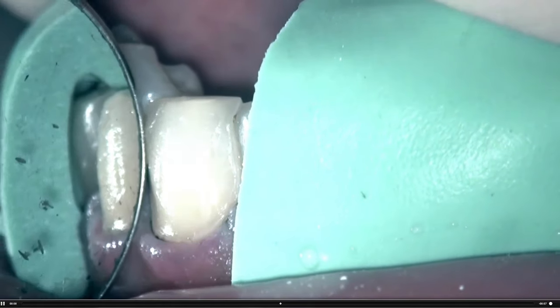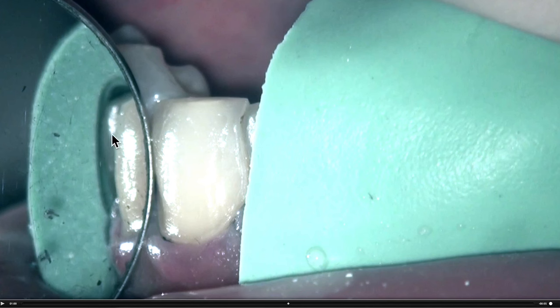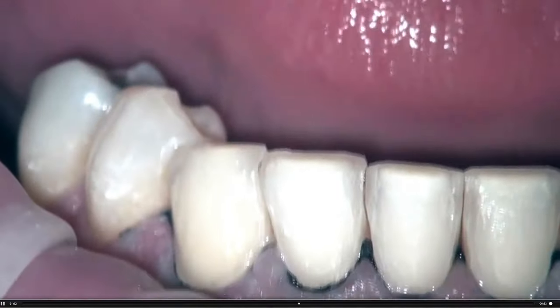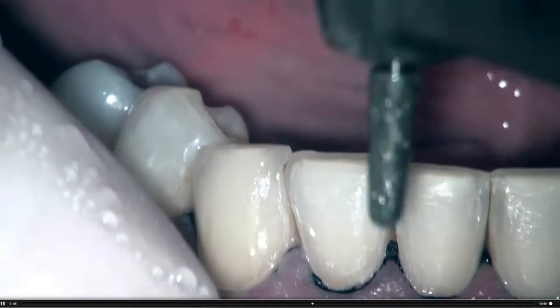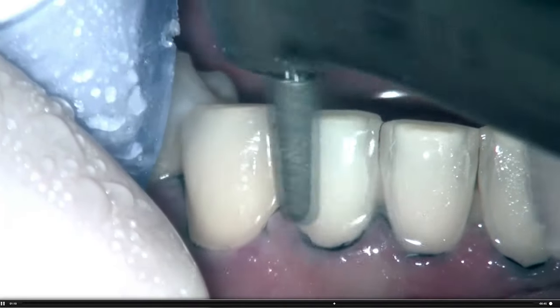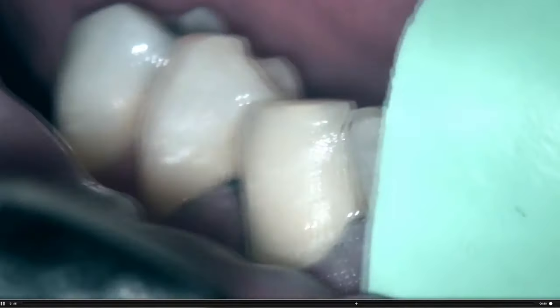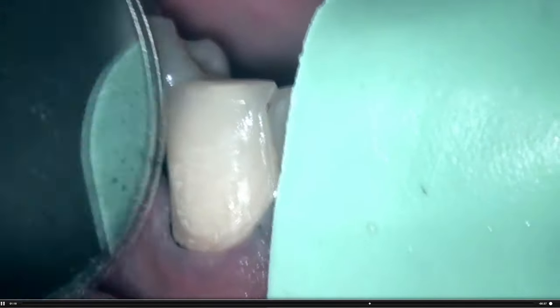Now I've sectioned the putty again, and we're looking at the lateral incisor. I have an area — this is a common spot — on the incisal-body third where I've under-reduced slightly. So we're going to go in and use that KS diamond again and just reduce this to give the ceramist the correct space for the porcelain veneer. These are conservative veneer preps, but I want to give them about half a millimeter of space, at least five to six tenths.